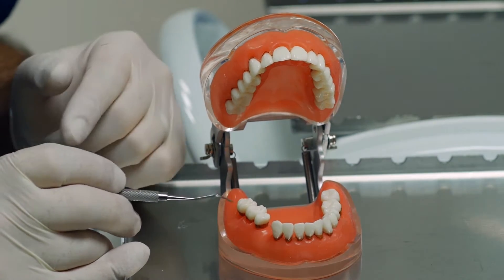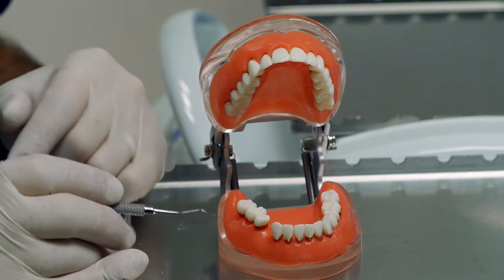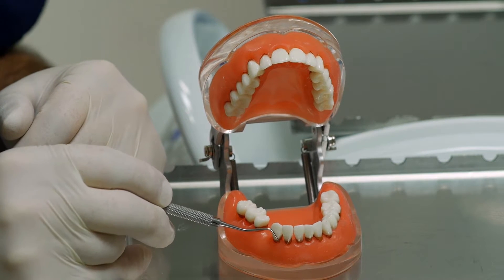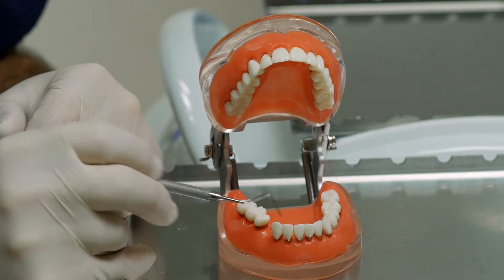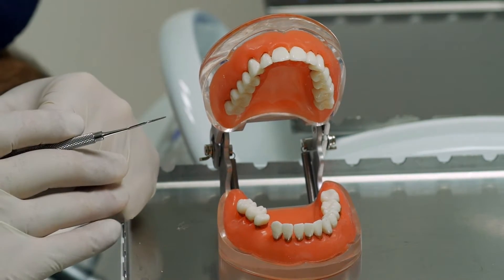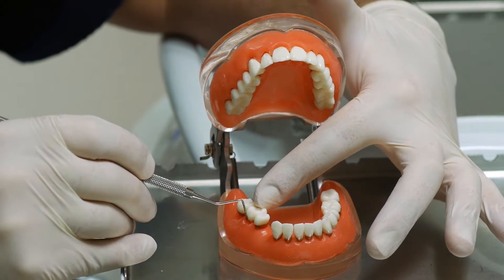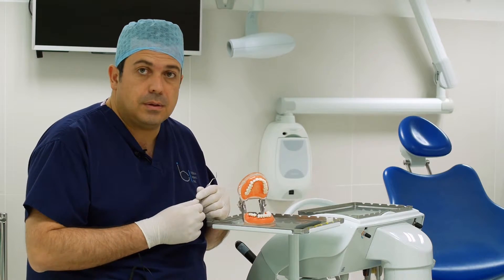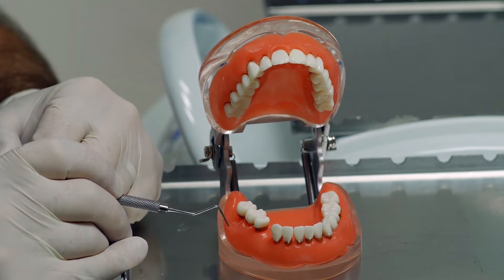Your dentist will gently introduce the probe to the sides of the teeth and call out a number to indicate how deep it goes. A smaller number like one or two is considered quite normal, but the higher the number, the deeper that little pocket becomes and the more difficult it is to clean with conventional brushing or flossing.